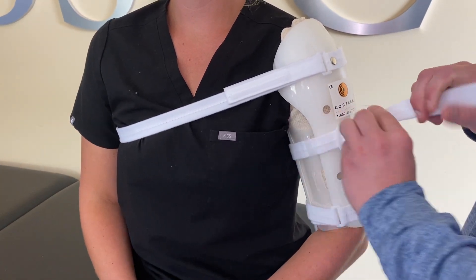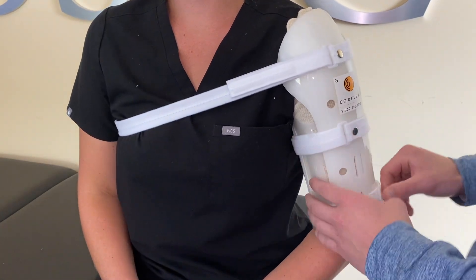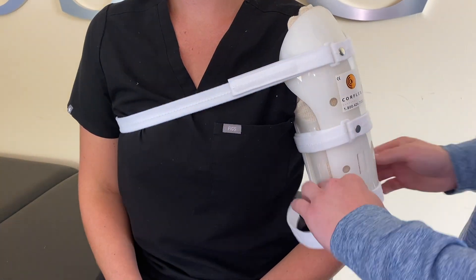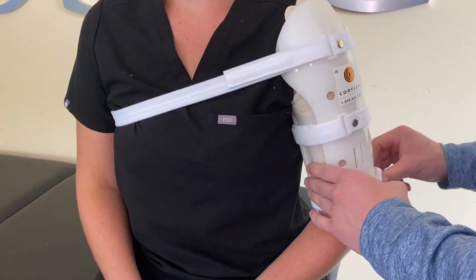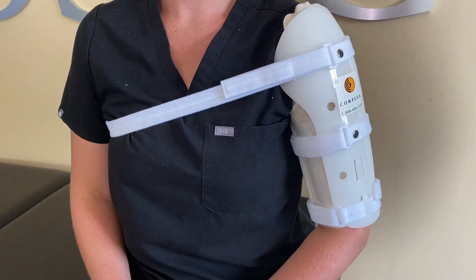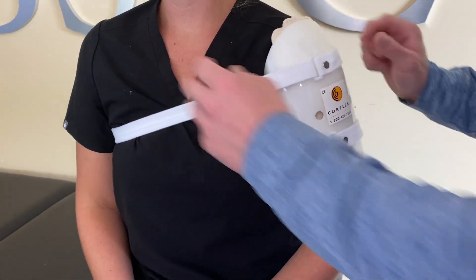If you feel the splint has migrated or slipped down your arm, the splint may not have been in the correct position or the straps may not have been tight enough. To fix this, loosen the straps on the arm portion. Slide the splint up your arm to ensure the deltoid cap, or the round portion, is at the top and in line with your shoulder. Next, tighten and refasten all the straps to secure in place.